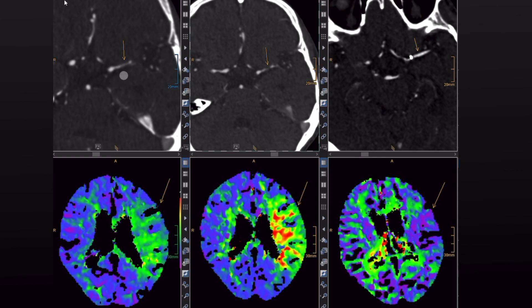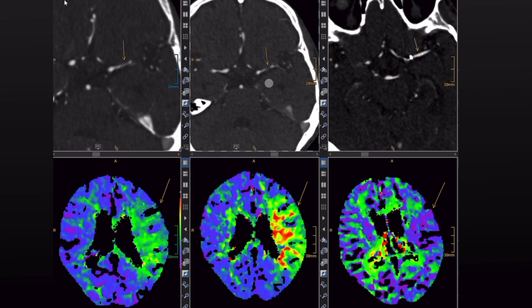As you can see, she has a high-grade stenosis of the M1 segment of the left middle cerebral artery with a delay in the time-to-drain on CT perfusion. Initially, the patient was treated only with dual antiplatelet therapy with ticagrelor and aspirin. Three days later, the patient deteriorated and developed global aphasia with hemiparesis, scoring five points on the NIHSS scale.